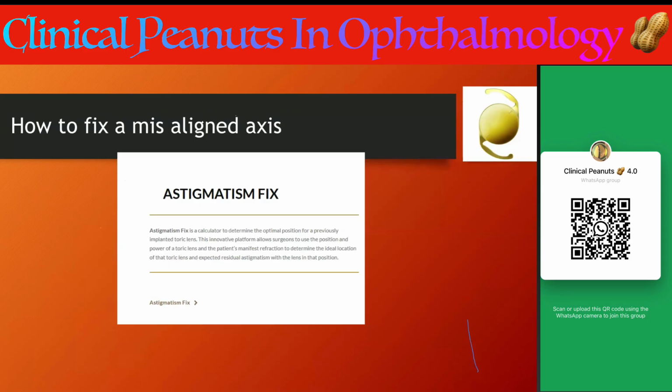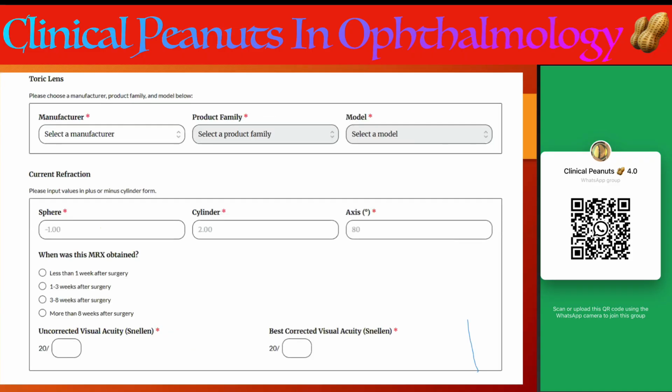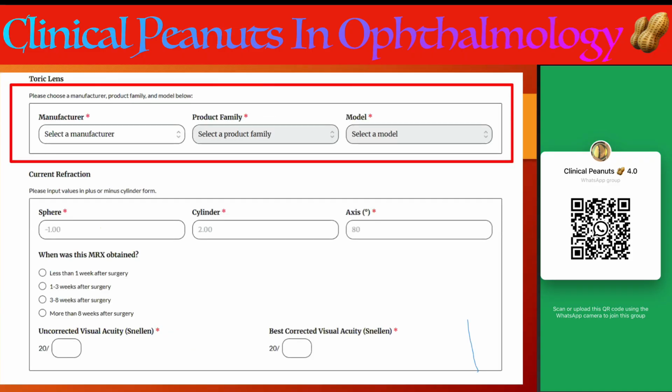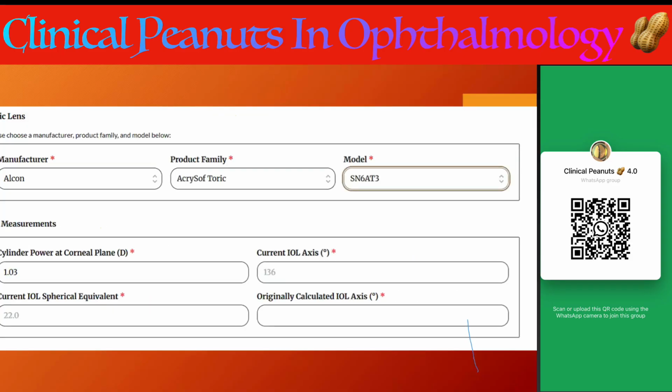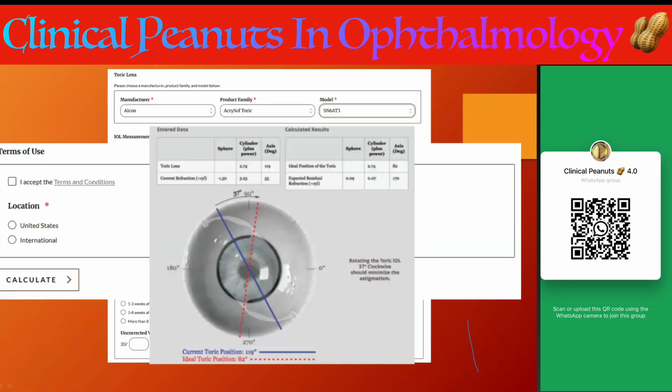www.astigmatismfix.com. There you need to put in all the data, yours as well as the patient's data and the manufacturer data. Once you put the manufacturer data, it will come in this form, and you'll have to put the model number, the IOL measurement, the current IOL axis and the original calculation. These all you'll have to put, and then the current refraction value: what the refraction is with this, and how much time has passed post-op. If you put these all in, then you will get something like this, which will tell you by how many degrees you need to reorient the toric to get the ideal toric position.